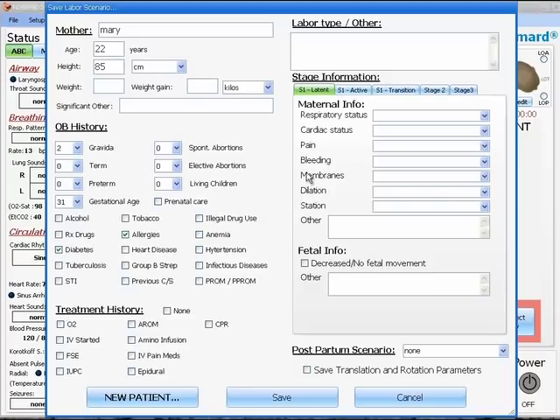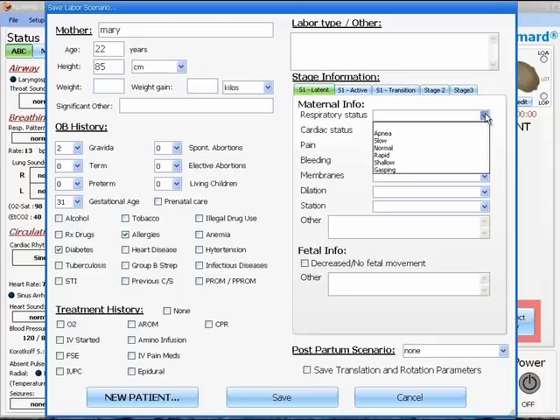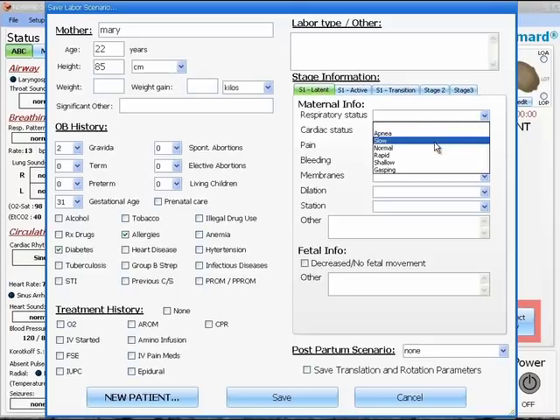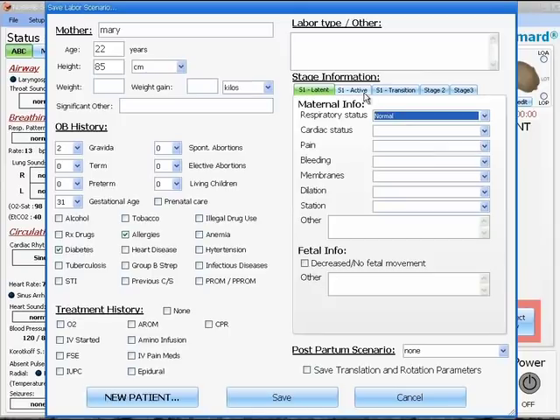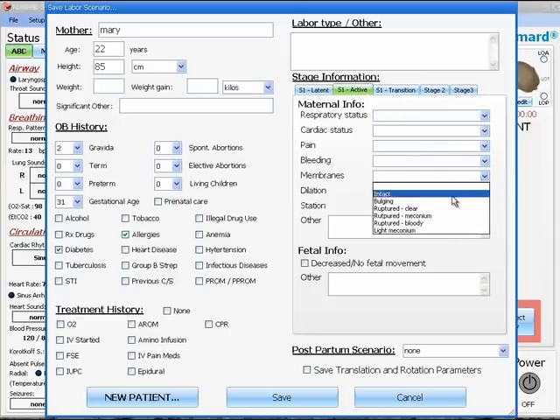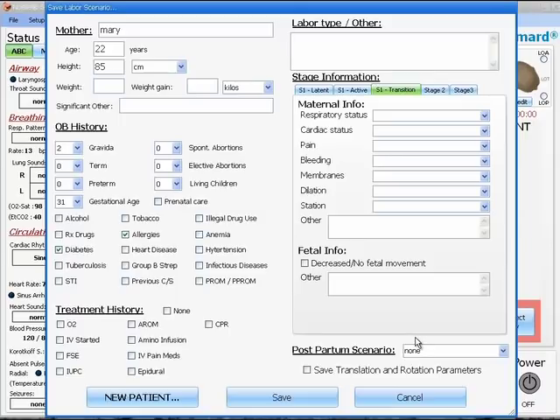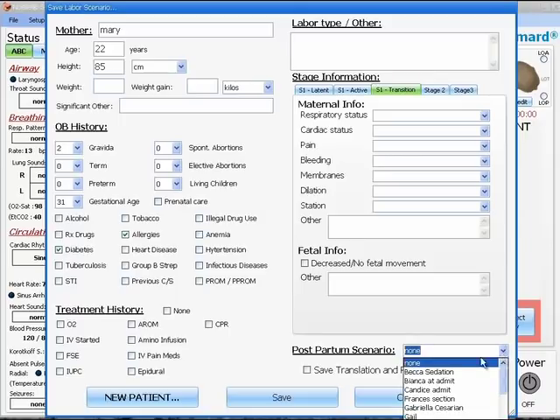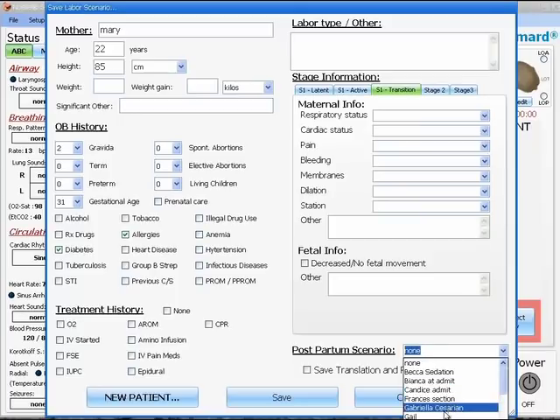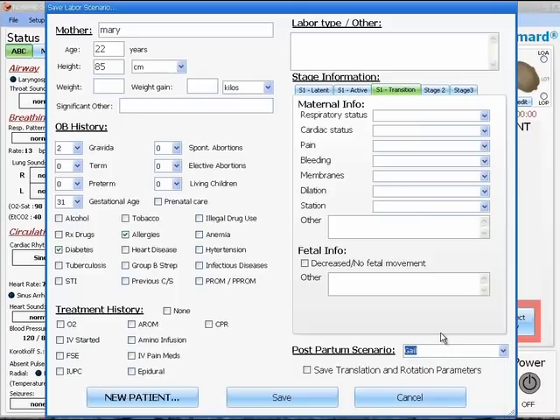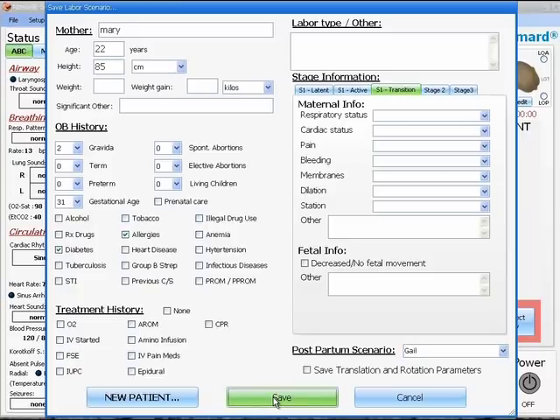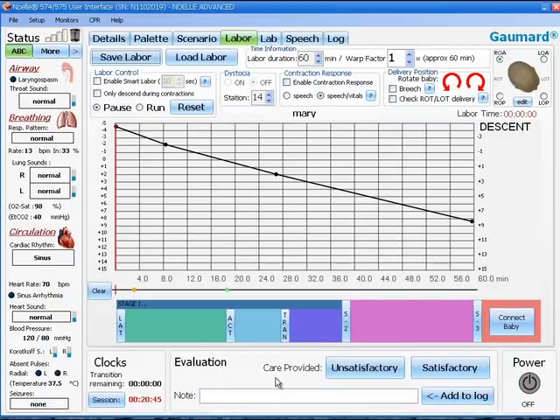On the right hand side, there is a box entitled stage information. Here you can put in notes for each of the stages of labor for other instructors to use and understand what is going on in your scenario. At the bottom of this box, you can also add in your postpartum scenarios to be linked to the birthing scenario. If you select one of these, as soon as the baby is delivered, the software will switch over to the scenario screen and begin running your postpartum scenario.